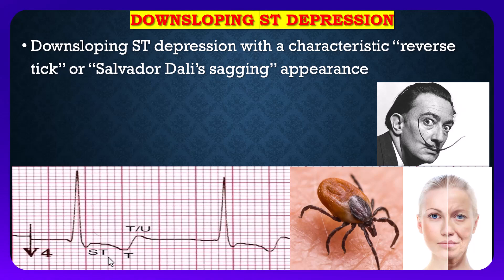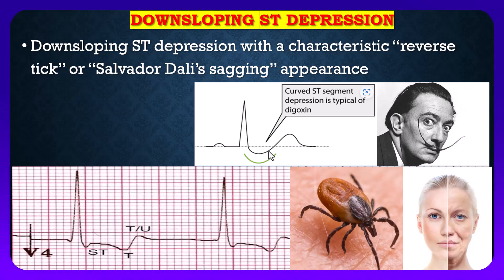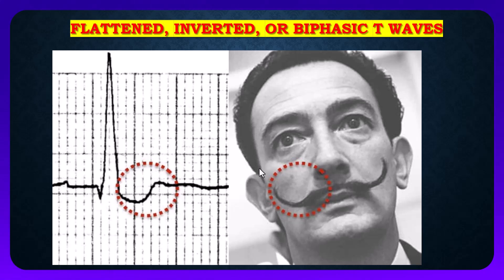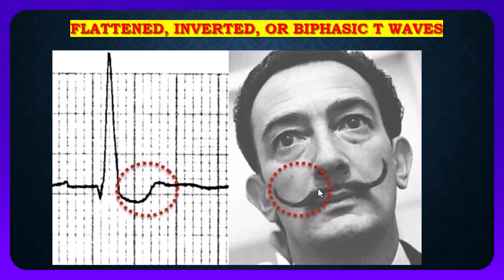This is a typical ST segment depression with digoxin medication. The second sign of digoxin medication is a flattened, inverted, or biphasic T wave. You can see the T wave — it may be either flattened, inverted, or biphasic. You can see that after the ST depression there is a flattened T wave, and there can also be a downward curve in most stages.